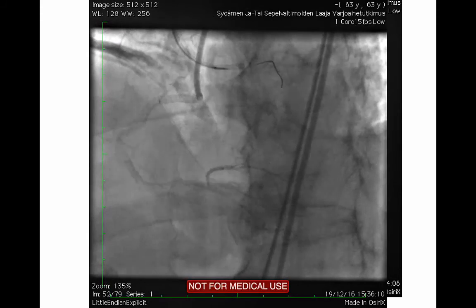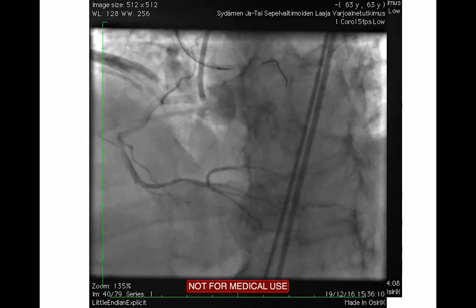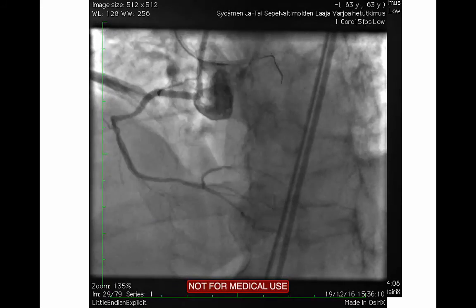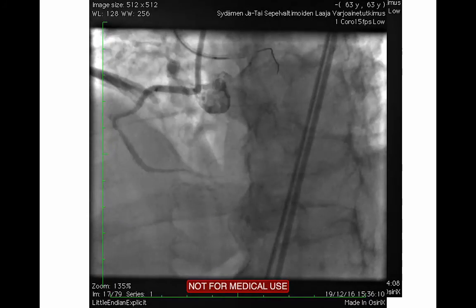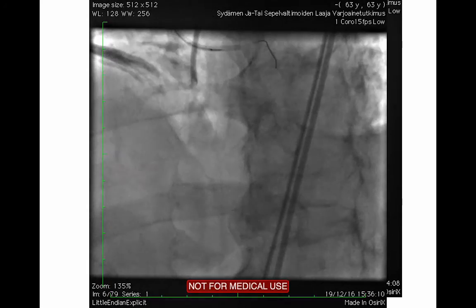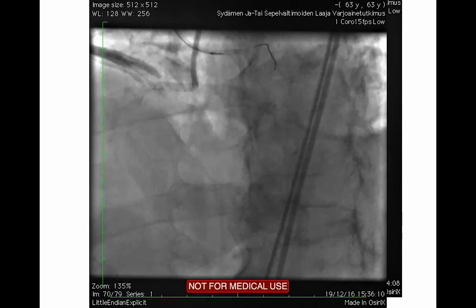And then the third lesson is how to snare, and it was a very nice demonstration that you want to use the 3-loop snares if you can. And as you said, you don't want to be pulling the snare, but you're going to be pushing the wire from the retrograde guide so as to avoid the guides coming in and causing strangulation of the heart, essentially. So I think these are very key points to know when we do retrograde in general, and of course, specifically on the right coronary artery.